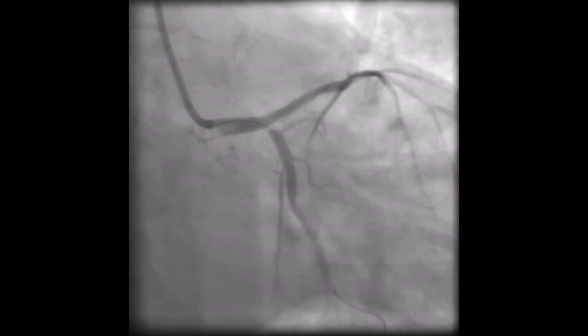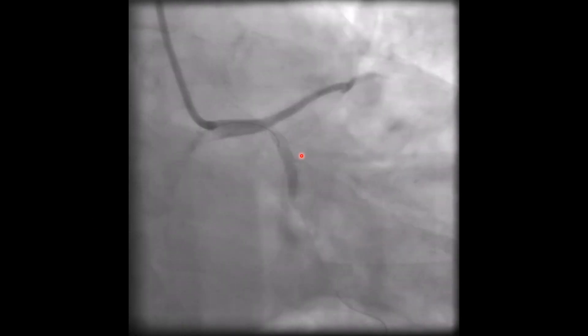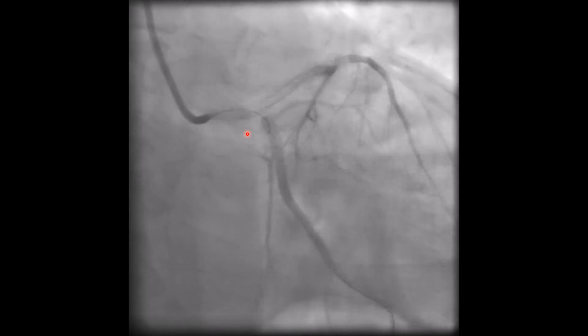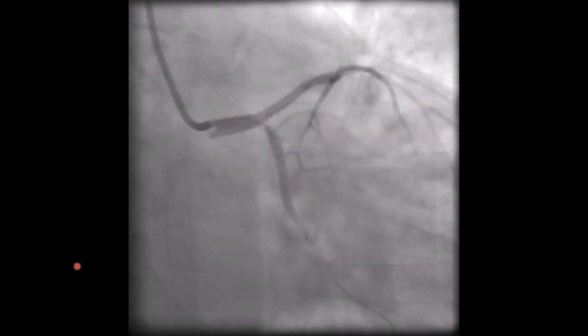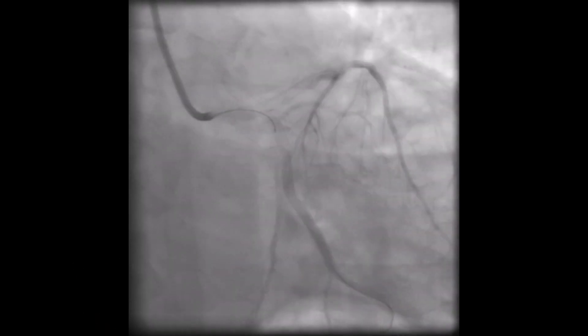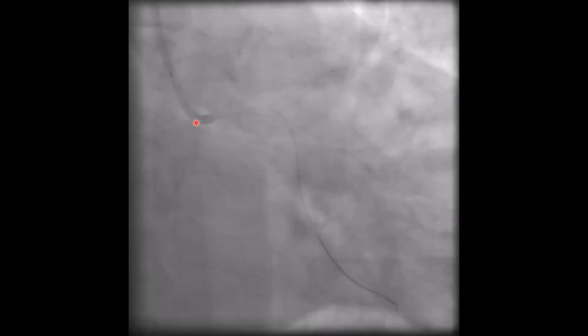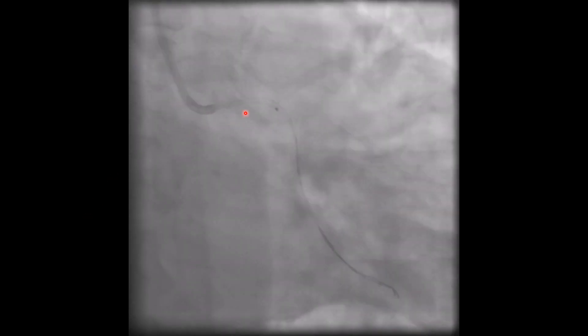However, a 1.5 mm balloon didn't pass through the stent struts. So we passed another wire closer to the first wire, and it seems to be in a better position. At this time, the balloon passed easily through the stent strut.